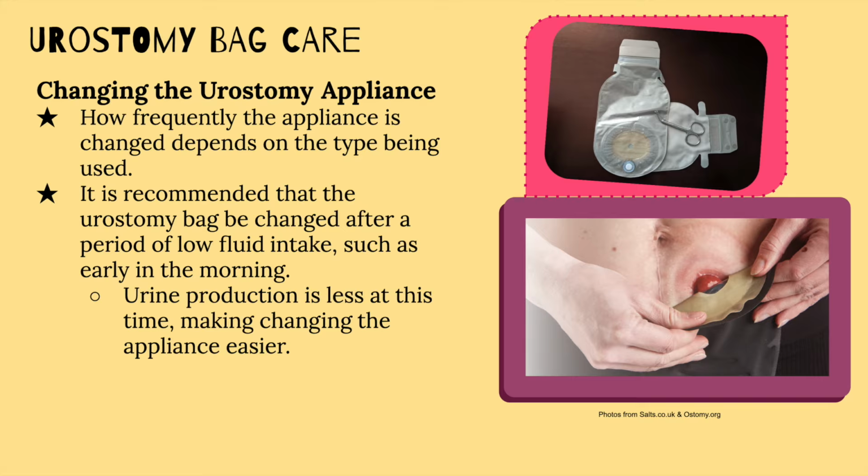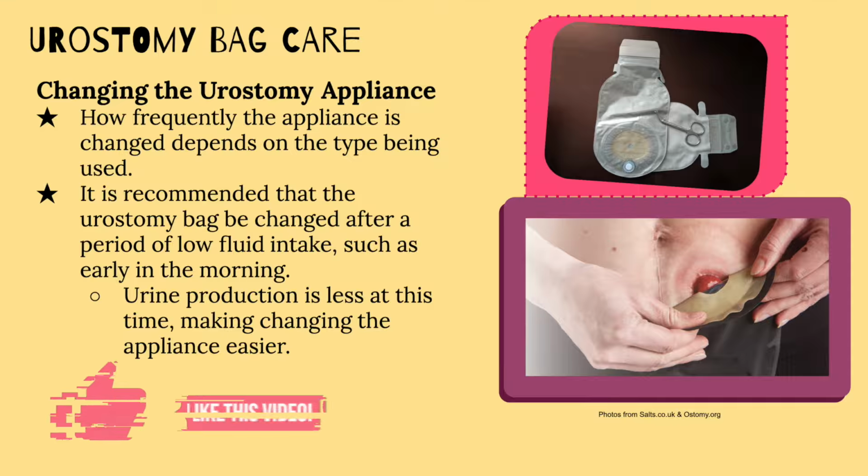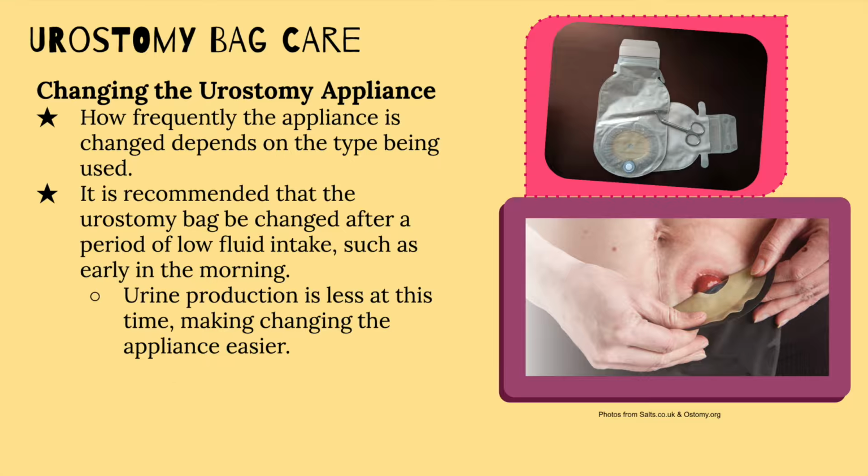So let's talk about how often the entire urostomy bag should be changed. How frequently the urostomy bag should be changed does depend on the type of urostomy bag being used. Now, it is recommended that the urostomy bag is changed during a time of low fluid intake, such as early in the morning. Urine production is usually lower at this time, which makes changing the appliance much easier.